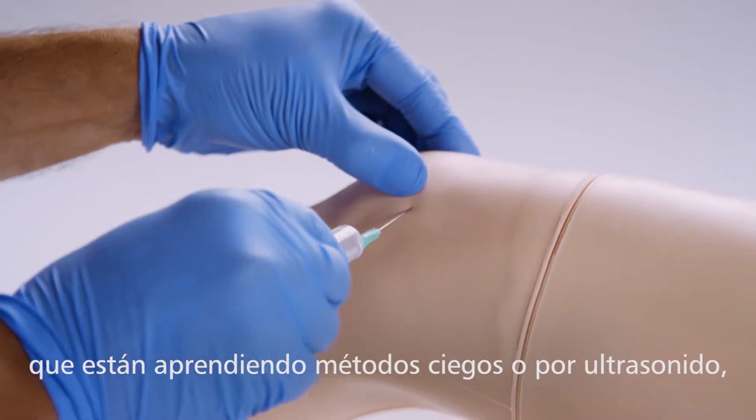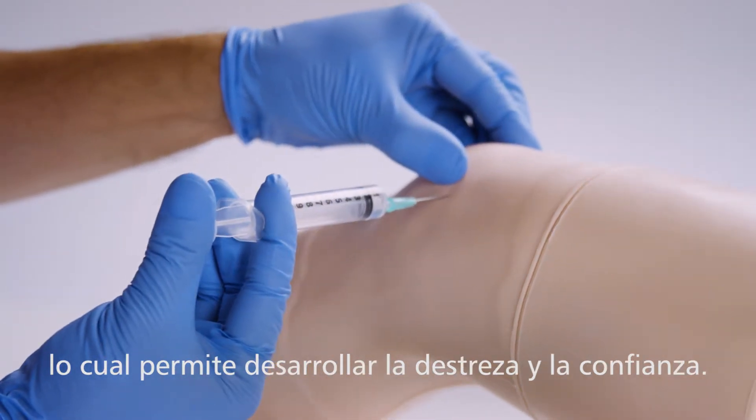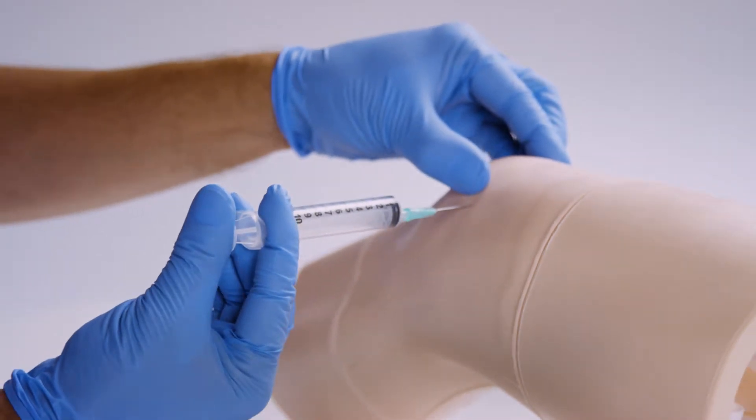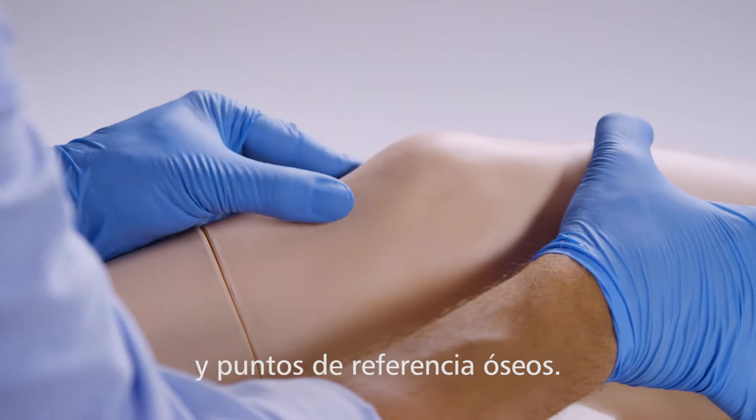Suitable for both blind or ultrasound guided methods, allowing trainees to develop their skills and confidence. Realistic to touch, it includes synthetic soft tissue and bony landmarks.